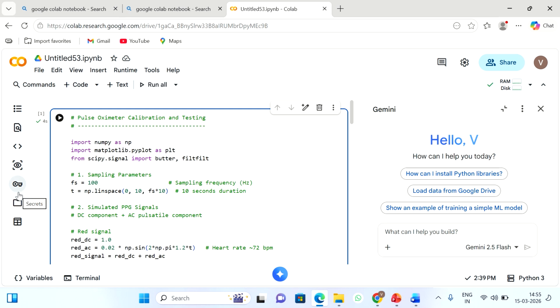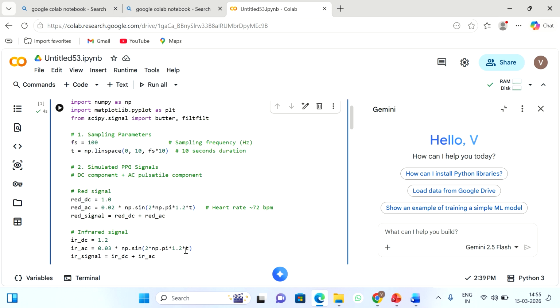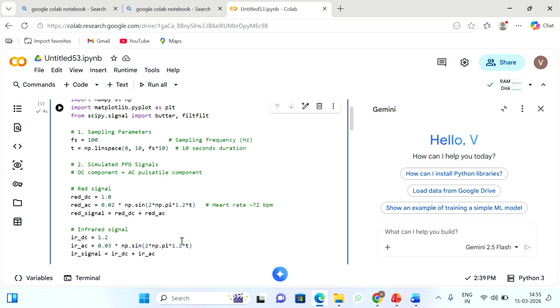We have to convert into angular frequency. So omega is equal to 2 pi f, 2 pi 1.2 t. So it is a very low frequency from our body, that too from the heart, that is why 1.2. It is a standard value for all humans, and then the total red signal is equal to the DC component in addition to the AC component.